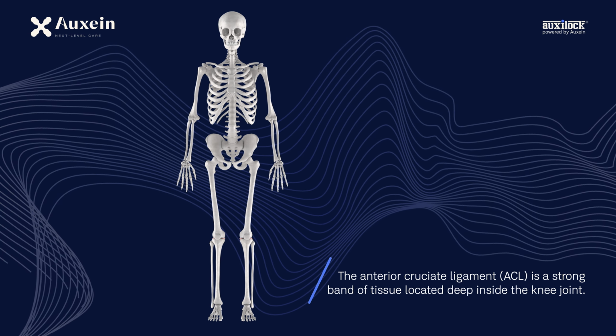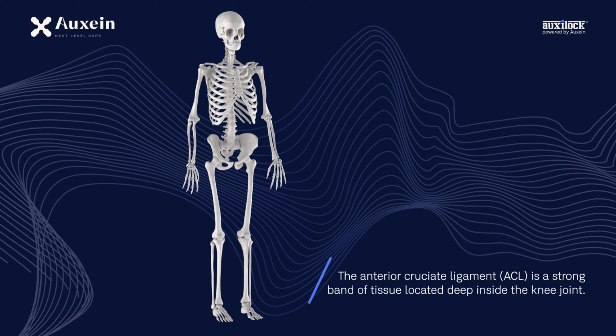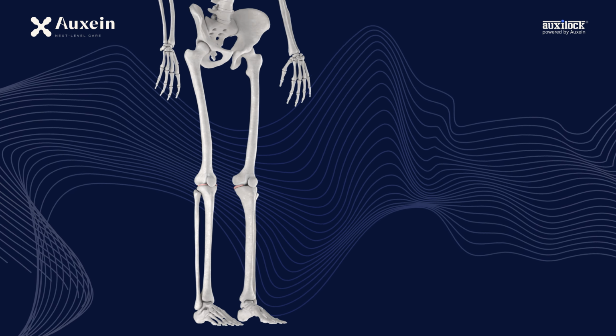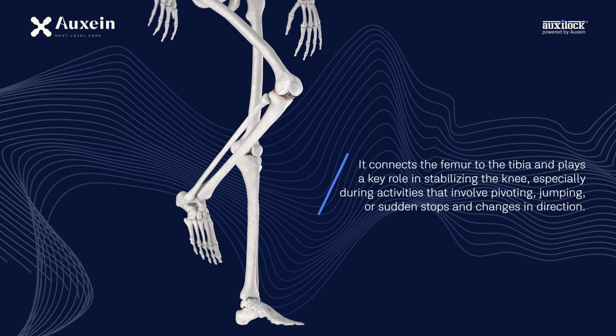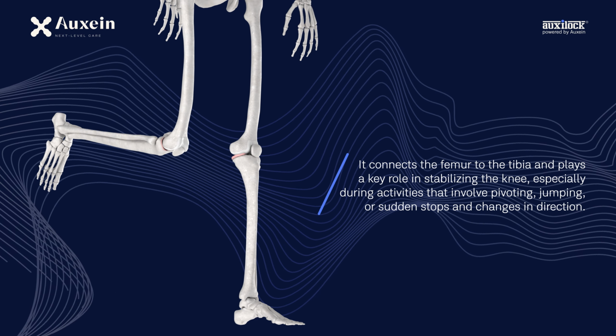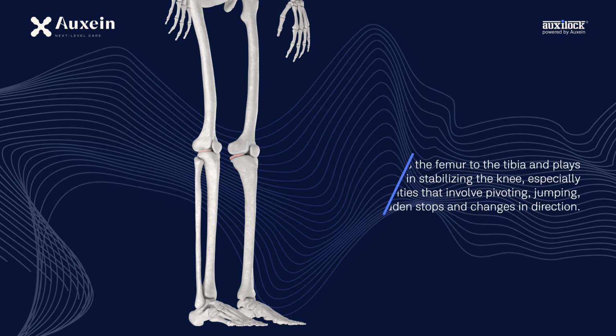The anterior cruciate ligament, ACL, is a strong band of tissue located deep inside the knee joint. It connects the femur to the tibia and plays a key role in stabilizing the knee, especially during activities that involve pivoting, jumping, or sudden stops and changes in direction.